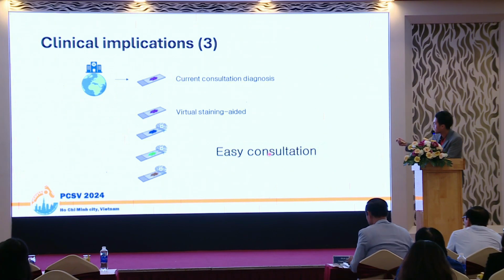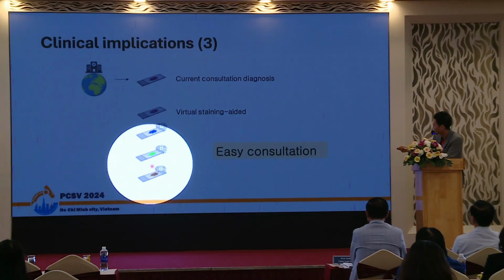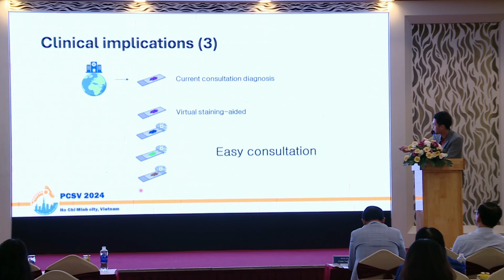Or third, I think it could be useful for consultation cases because usually I get a consultation kidney biopsy with only one H&E stain. In that case, the virtual stains can make the consultation much easier and make a more confident diagnosis.